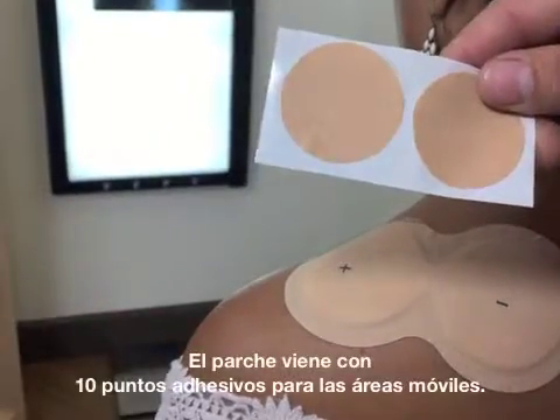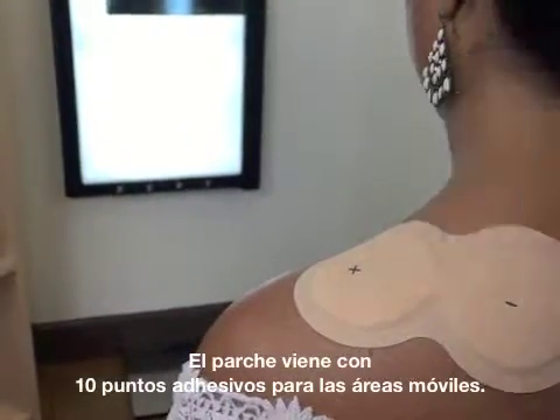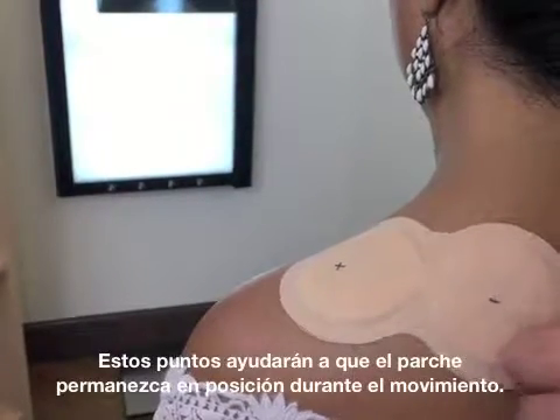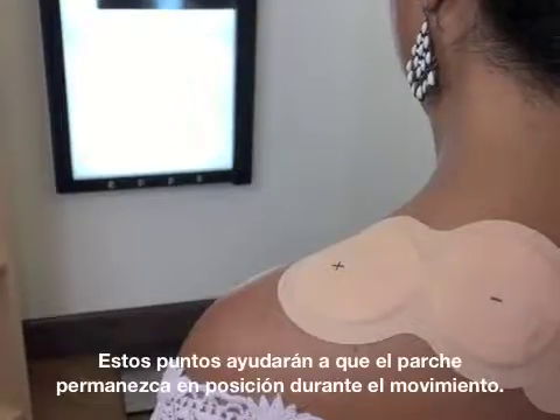The patch comes with 10 adhesive dots for mobile areas. These dots will help the patch stay in position during movement.